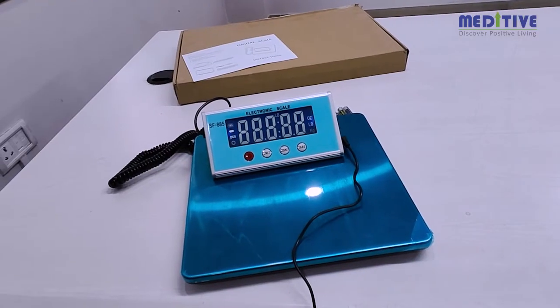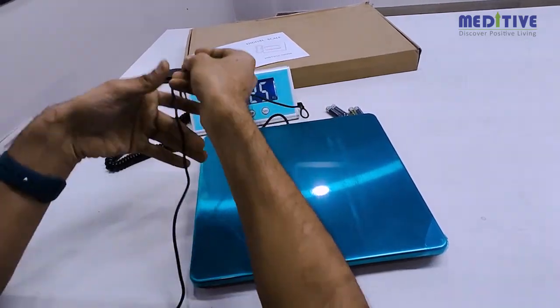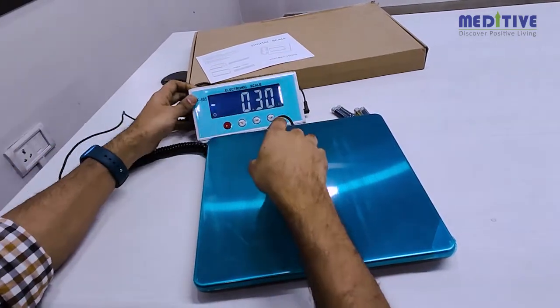Press the power button to switch on the scale. White backlit digits will be displayed. Make sure the reading starts from zero before you start measuring.